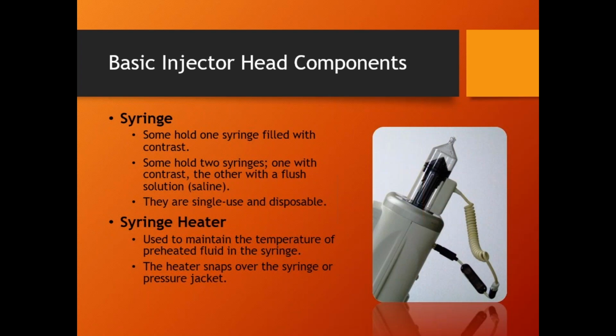But CT and MRI injectors do often, and you almost say always, use a saline syringe. MRIs, all MRI systems use saline. Most, and when I say most, like 99% of CT injectors use saline. There are single head CT injectors, but they're pretty rare. And with modern CT systems now being 64 slice and 128 slice and stuff, you would not put a single head on. The single head means just contrast syringe, no saline syringe. You would not put a single head syringe on a multi-slice CT injector. You lose the ability of that MRI or that CT injector to perform some of the images without the saline during the shot. So the vast majority of CT injectors, you can't say all of them, but almost all of them use contrast and saline syringes.